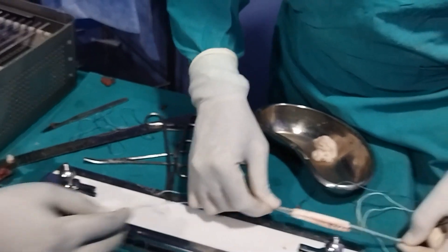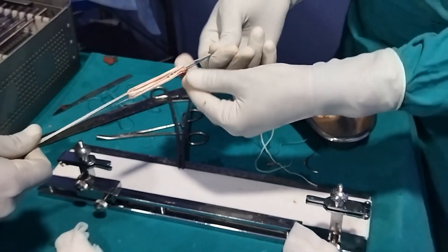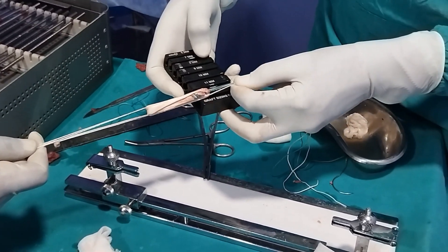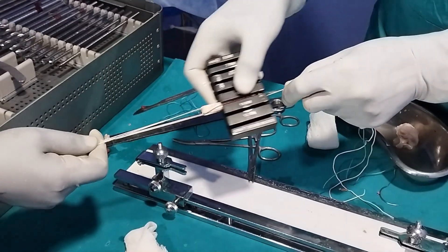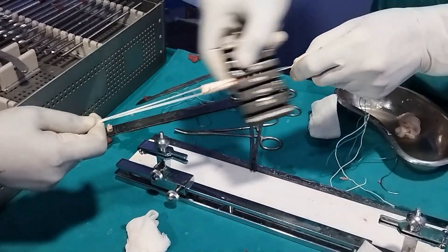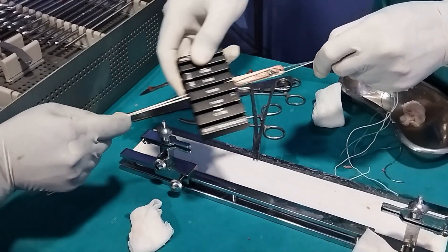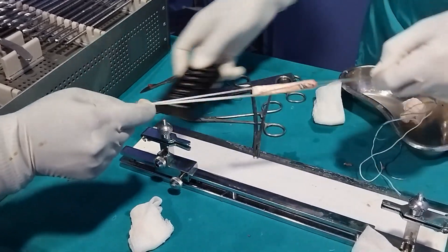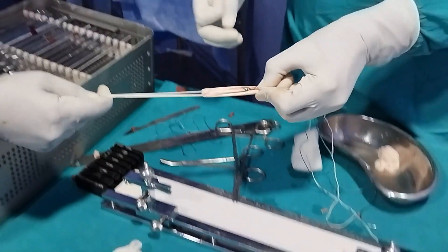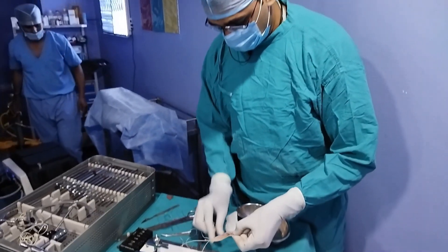We take the length of this quadrupled graft — it is around 7 centimeters, which is good. The original graft length was 28 centimeters, so in a quadrupled configuration it comes out to 7 cm, and it is quite a thick graft. To size the graft, we use a sizer: it passes freely at 10 mm, and passes well at 9 mm with slight resistance, but does not pass at 8 mm. Therefore the graft diameter is 9 mm and the length is 7 centimeters — confirmed as 9 by 7, uniform.